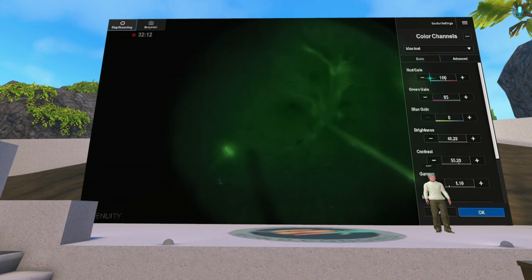I'm sure that LED or solid state laser light sources might be more precise in terms of wavelength, but this is something that we need to ask, for example, Alcon to think about for the next generation of endoillumination. Mm-hmm. Sure. No, I completely agree.